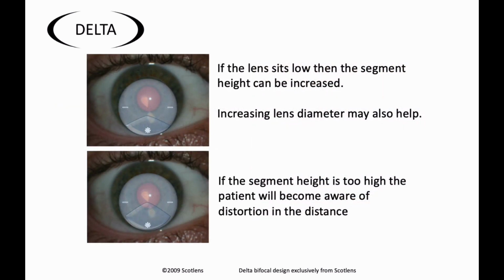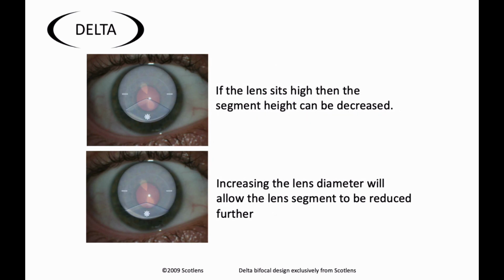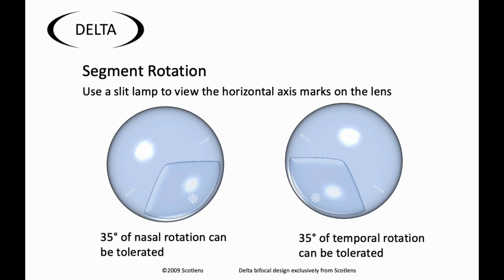If you've got a case in the top picture where the lens is sitting very low, the patient may complain that they're not getting the reading when they look down. In which case you can increase the segment height up to on HCL, which would be 0.5 mm higher, or you could also try and increase the lens diameter to force the lens to go up. Of course, if the lens is sitting low and isn't moving, then the translation effect may always be missing from the fit. If you've got a lens that's sitting a bit high, you can lower the segment. Again, you still want to have that lens movement with blink. And as I said earlier on, rotation of around 35 degrees nasal, 35 degrees temporal can be tolerated without causing too much disruption to the near vision.